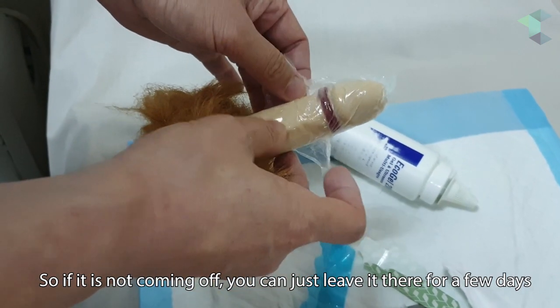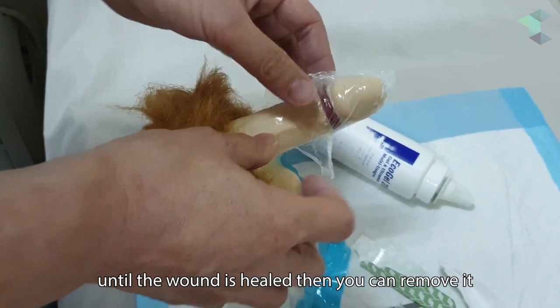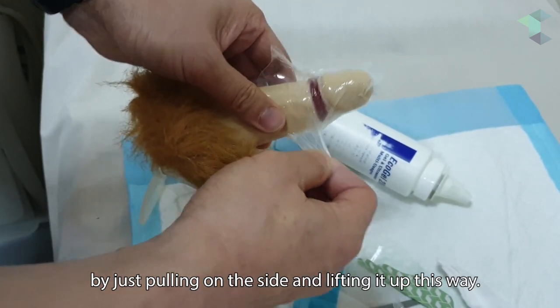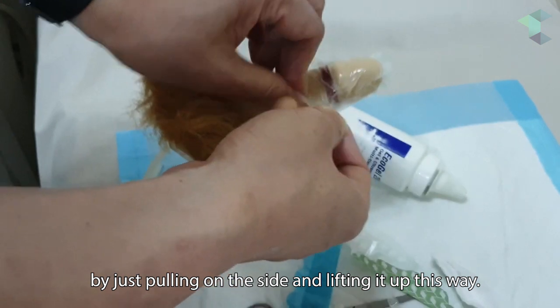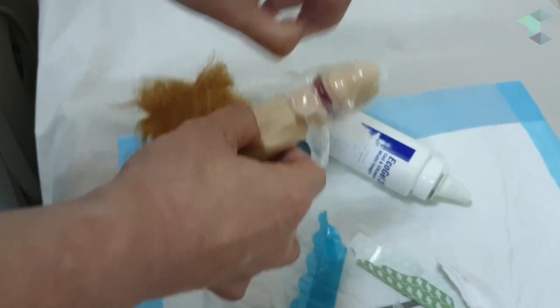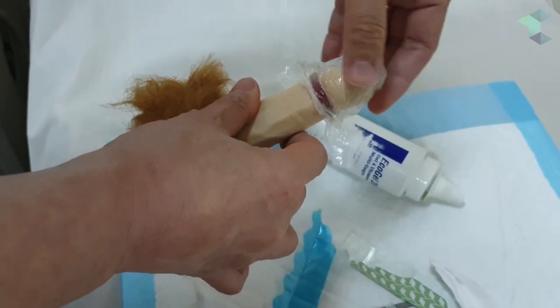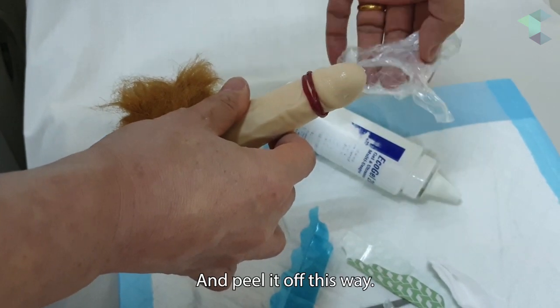If it's not coming off, you can just leave it there for a few days until the wound is healed. Then you can remove it by pulling on the side and peeling it off this way.